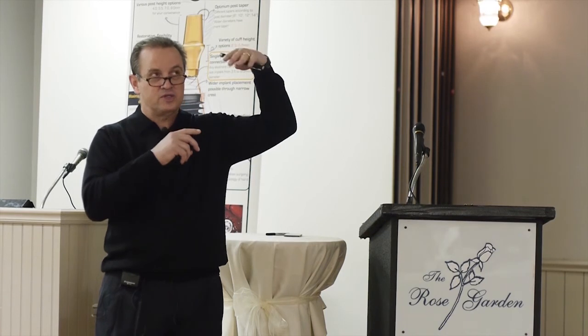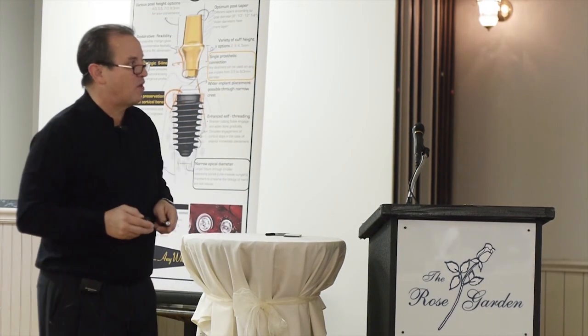It's just like this. Instead of taking out a stock abutment and grinding on it, with part of the margin supragingival and a bunch of it subgingival, it just doesn't work as well. It's kind of the same thing on the bottom.